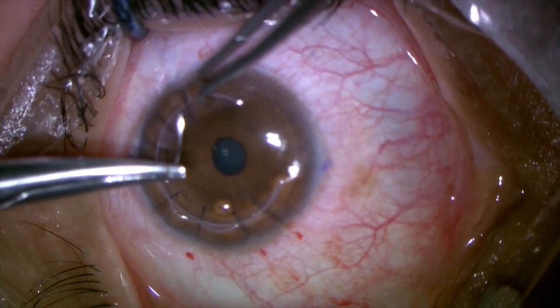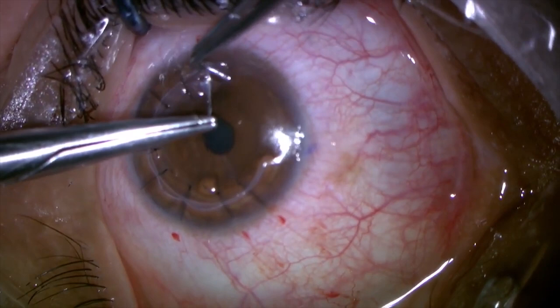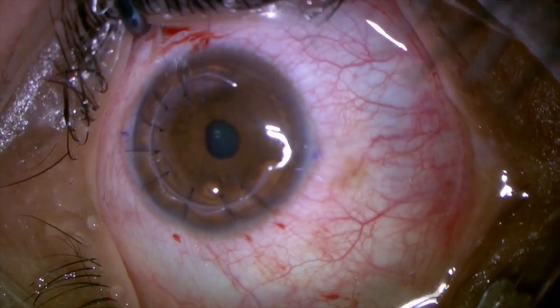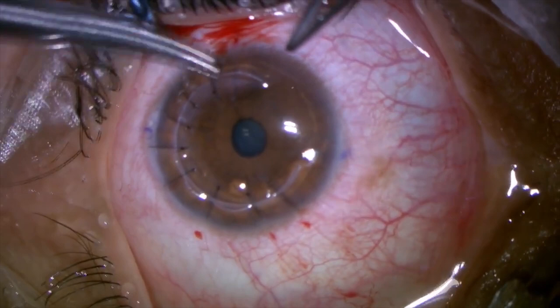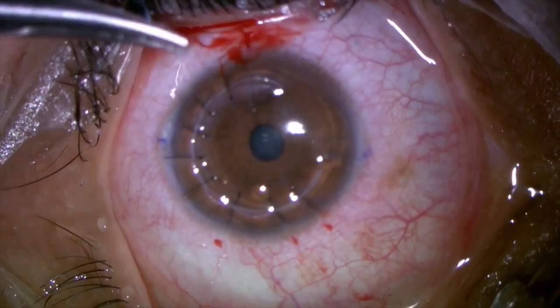Actually, from now on, it's just like a deep lamellar keratoplasty or like a penetrating keratoplasty. You just go perpendicular into the cornea, and as Dr. Carriazo said, it's a 90% depth. It has been quite easy to do because the eye is closed. There's really no exposure. We try to put the stitches more on the cornea and not next to the limbus, because if we go to the limbus, the experience is that they tend to loosen faster. So we try not to go into the limbus.